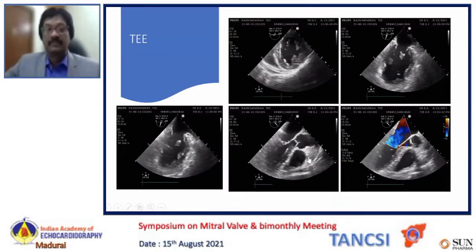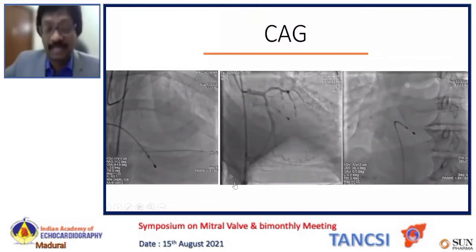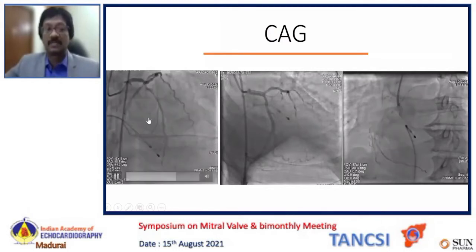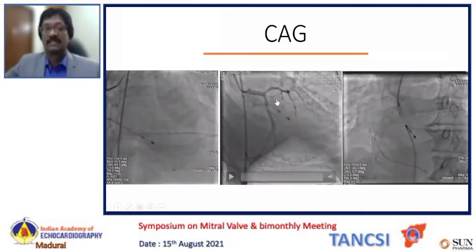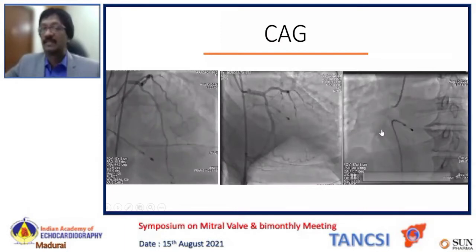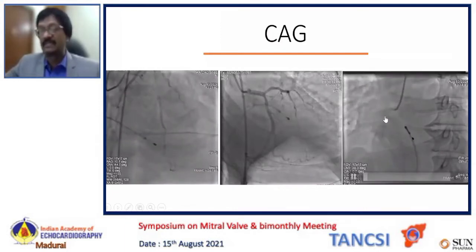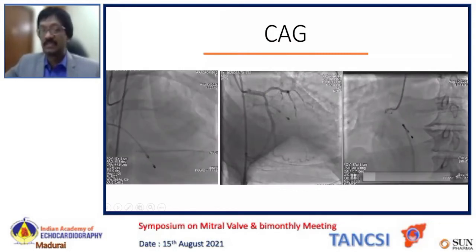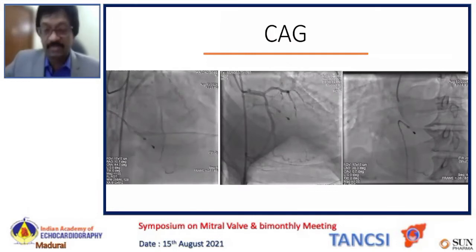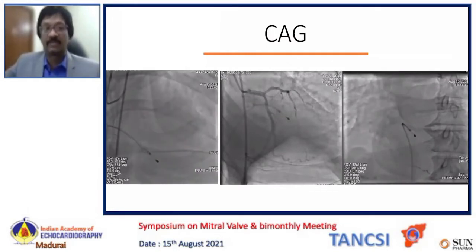And the angiogram, surprisingly, showed a ramus occlusion, a very small ramus occlusion. LAD is normal. Like a high OM or ramus, we can call it a ramus occlusion in this view. And RCA also had some disease, we can call it co-dominant, with some stenosis. Maybe this could have triggered the anterolateral rupture of these papillary muscles, which is very rare, not common.